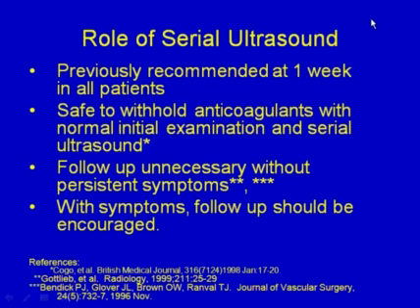What about serial ultrasound? Well, that was previously recommended at 1 week in all patients. However, now we basically do not recommend that if the first ultrasound is negative, unless the patient is very high risk for clots. It is safe to withhold anticoagulants if you have a normal initial examination and do serial ultrasound. And lastly, follow-up is unnecessary unless the patient has persistent symptoms. And if the patient does have symptoms, we would encourage follow-up examination in about 5 to 7 days.